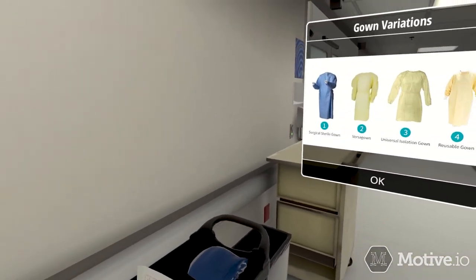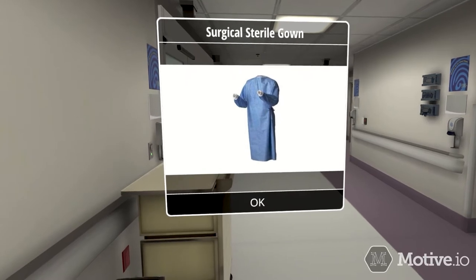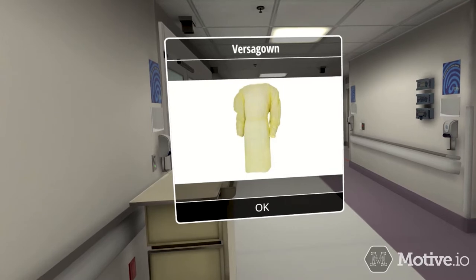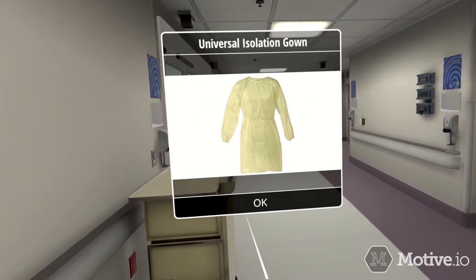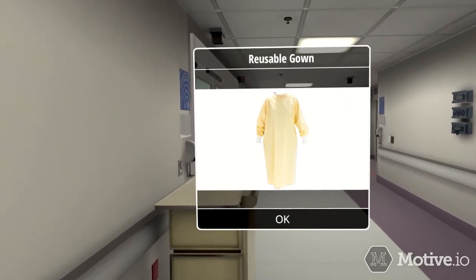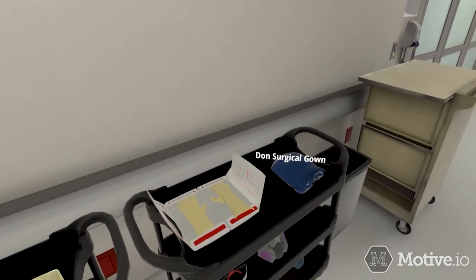Start by donning a gown. For airborne precautions, the best choice is a surgical sterile gown. The second best choice is a yellow Versa gown. Your third choice would be a cardinal universal isolation gown. If you don't have any of these choices available, you can don a reusable gown as a last resort. In this case, the surgical sterile gown is the best option available — don it now.